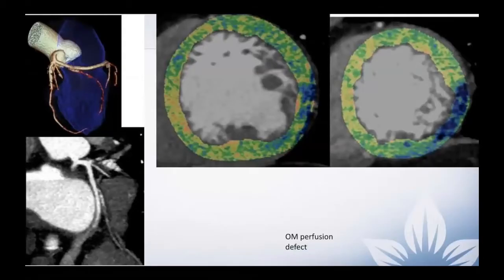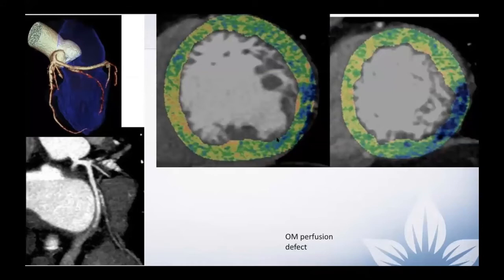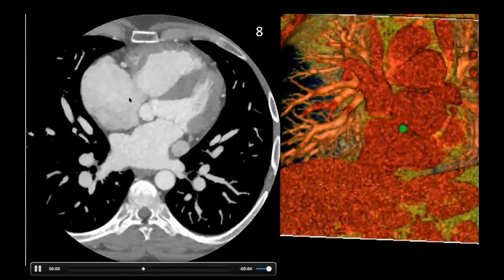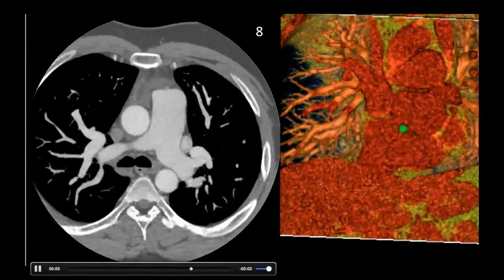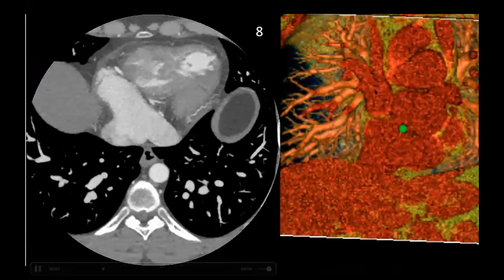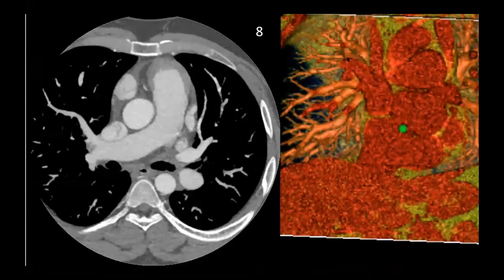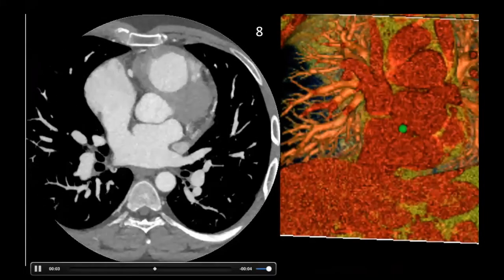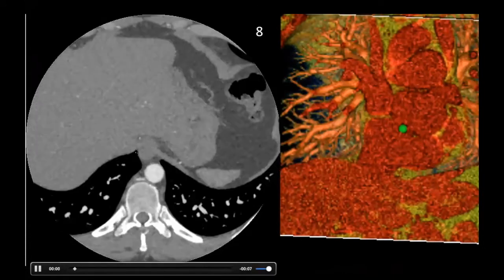CT perfusion is something being worked on and used at many institutes, though you do need specific high-end scanners to see areas of perfusion defects. You can see the OM vessel has disease in this patient, and then you can see the perfusion defect in the OM vascular territory in the same setting. Incidentally, this is also a patient with a superior sinus venosus ASD where there is anomalous pulmonary venous drainage of the right upper lobe veins into the SVC, found incidentally during a coronary CT angiography.